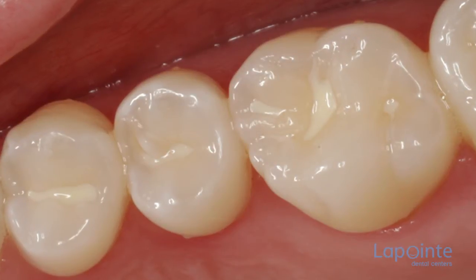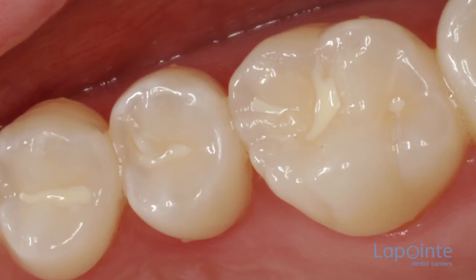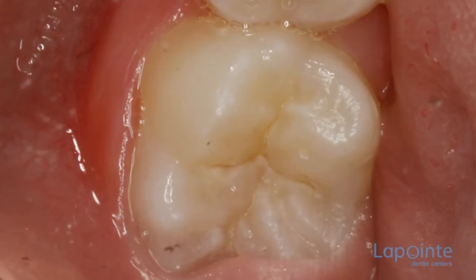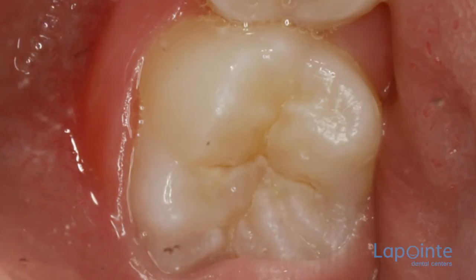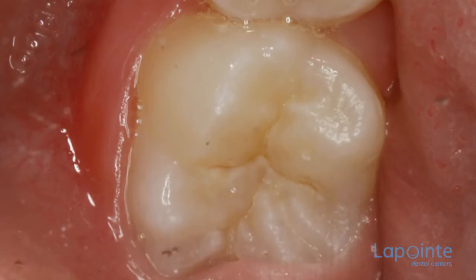Pit and Fissure Sealants, PFS, consist of an organic polymer that adheres to the surface of the enamel. The technique is several decades old. The goal of this treatment is a preventive measure aiming to protect the grooves in the enamel.